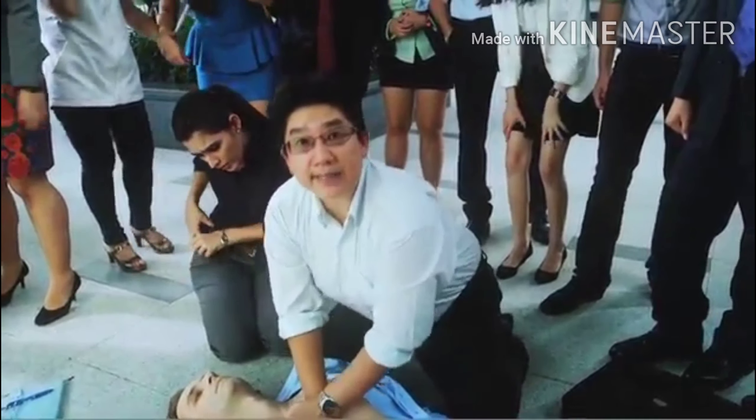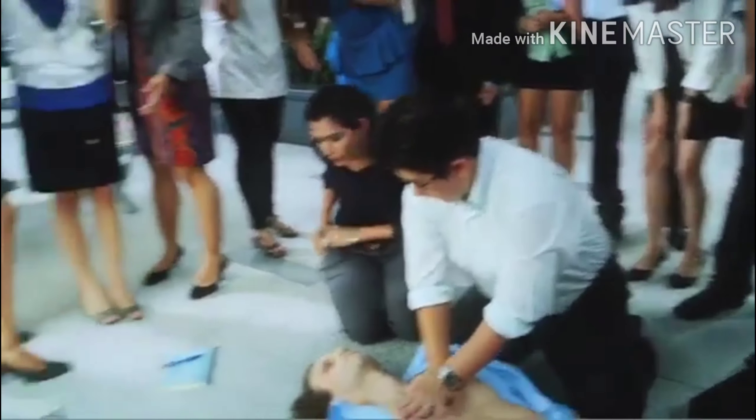Can you help me — may you get an AED please? Excuse me, wait, wait! Excuse me, sorry!